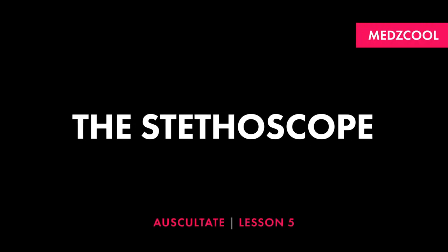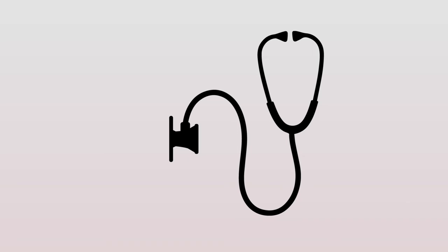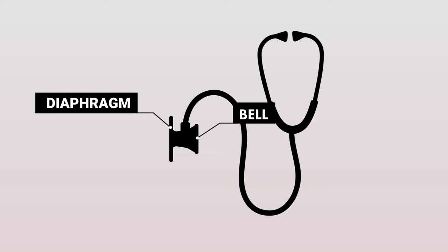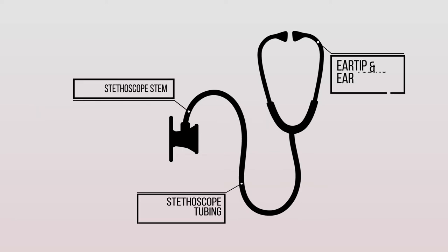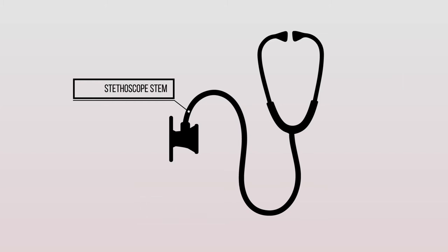Let's learn about the most important tool in medical auscultation, your stethoscope. Most stethoscope chest pieces have both a diaphragm and a bell. For simplicity's sake, we'll be talking about a stethoscope with a two-sided chest piece, with a diaphragm on one side and a bell on the other, like the one seen here. There are other parts to a stethoscope, but we'll be focusing on the use of the diaphragm and the bell in regards to medical auscultation.